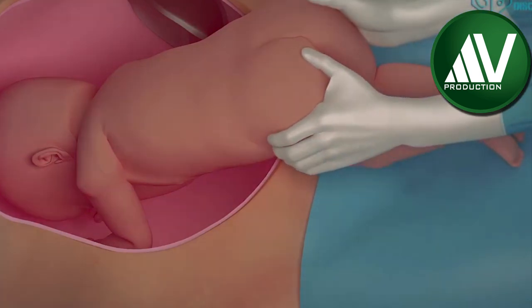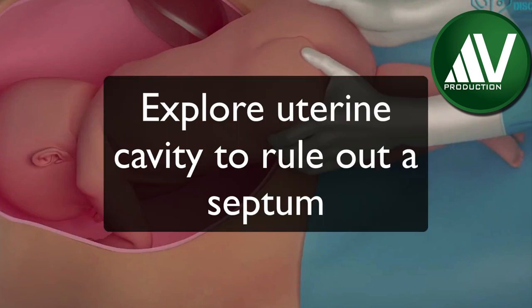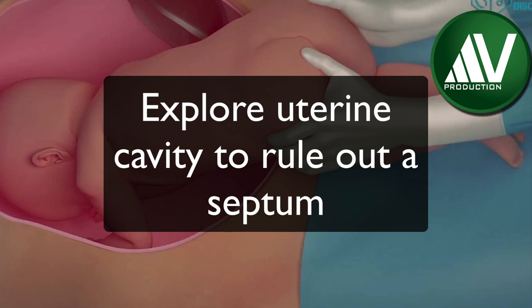And one more thing: after delivery of the fetus and placenta, always explore the uterine cavity to rule out congenital anomalies of the uterine cavity such as a septum.